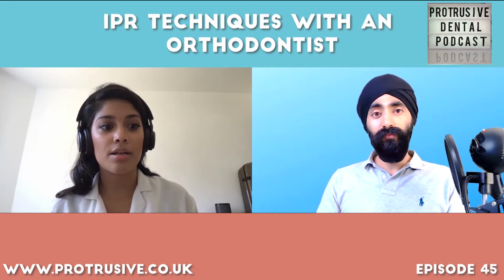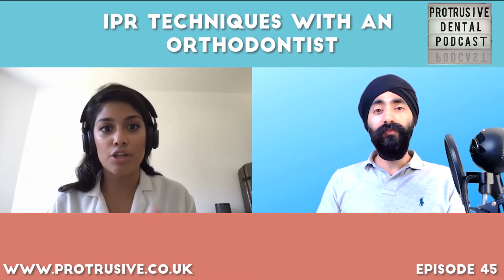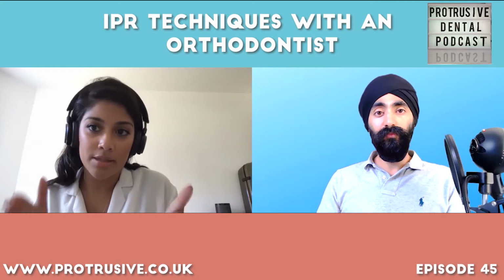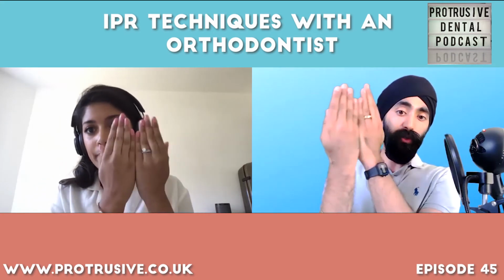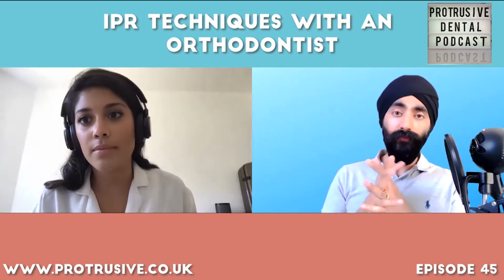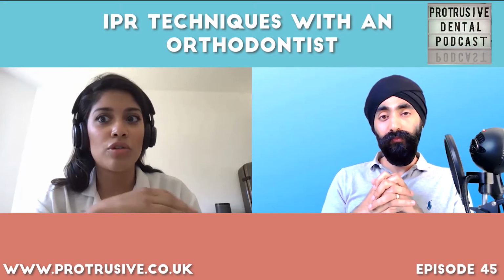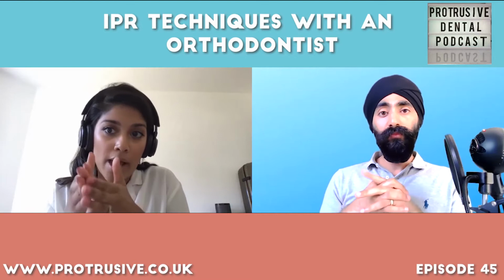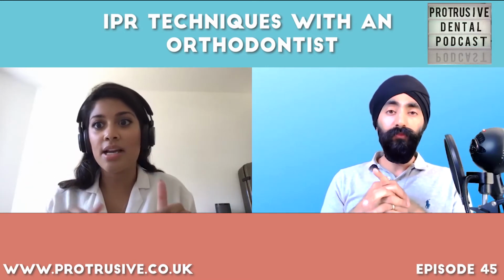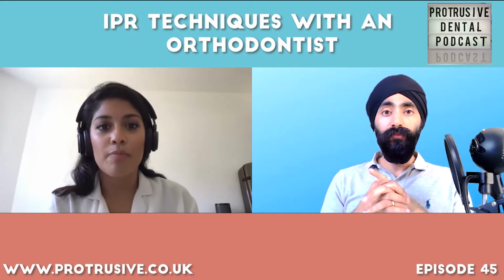If you've got a parallel tooth, by which I mean a rectangular shaped tooth, it's not really advised. There's a maximal area of contact between the teeth. Exactly. IPR in those sort of teeth is not really advised. Whereas if your central is triangular shaped, then you can afford to take away tooth tissue near the incisal contacts. So it would lend itself better.